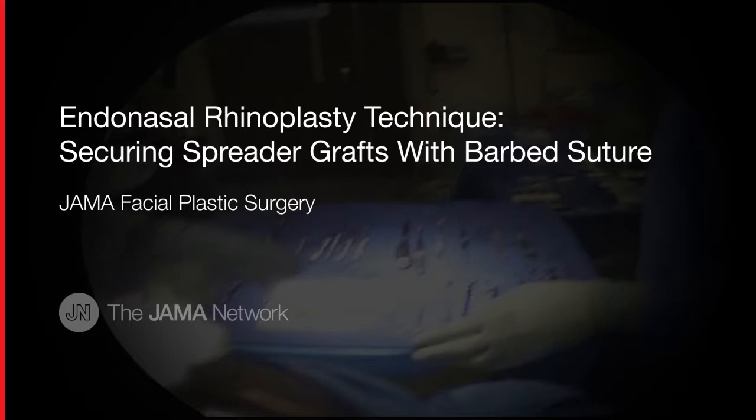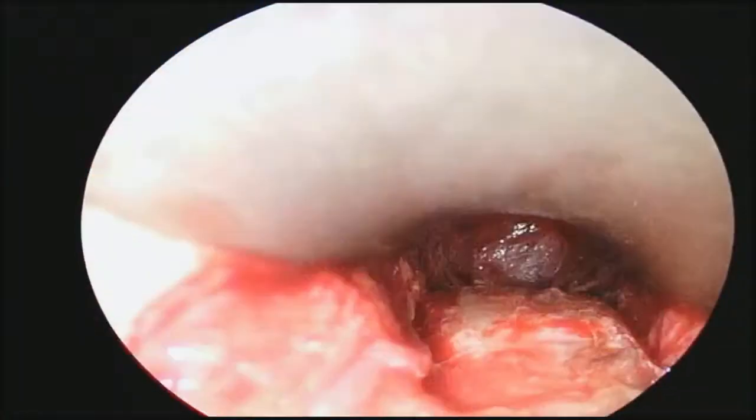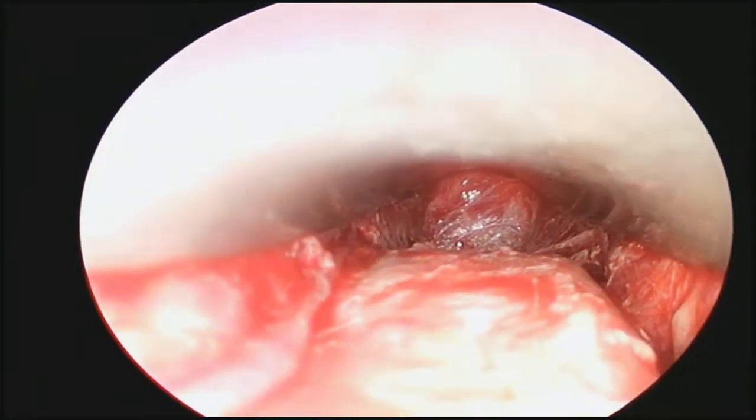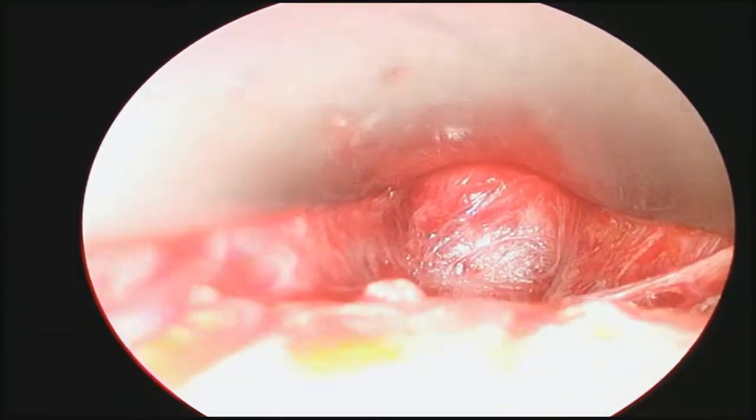Our endonasal rhinoplasty approach began with a full transfixion incision that transitioned into bilateral intercartilaginous incisions. The soft tissue envelope was elevated off the upper lateral cartilages and nasal bones. Bilateral mucoperichondrial septal flaps were raised, and septal cartilage was harvested to create spreader grafts.